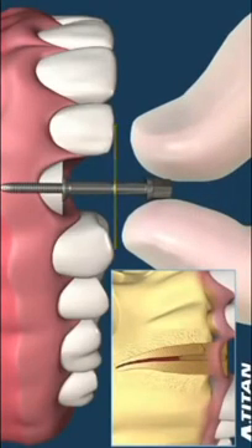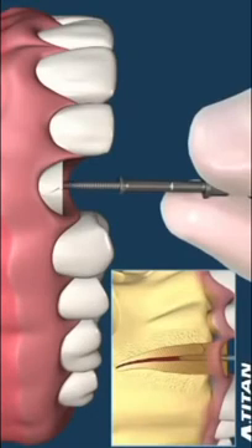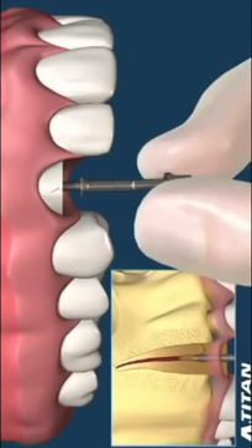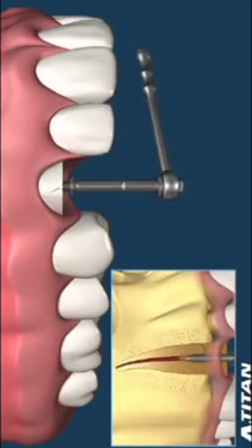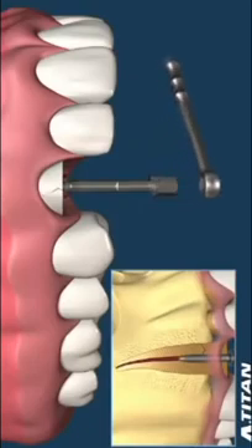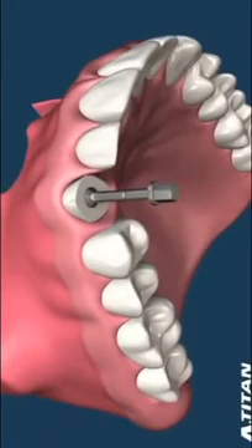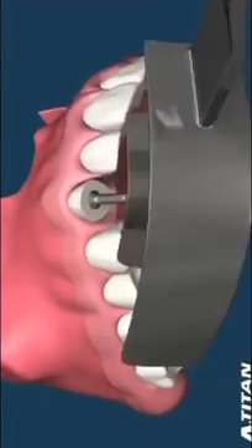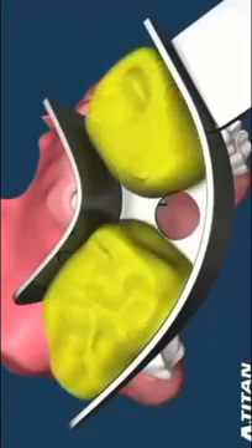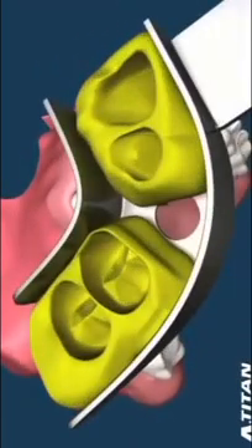The record line must be at or above the height of the tops of the adjacent teeth. The post is screwed into the prepared canal space with a hand wrench. The tray is checked to make sure the record line is at the level of the tray opening. Then the impression of the adjacent teeth is taken to that level.